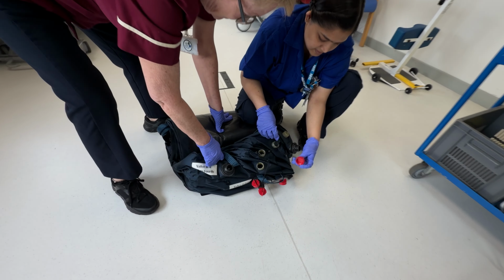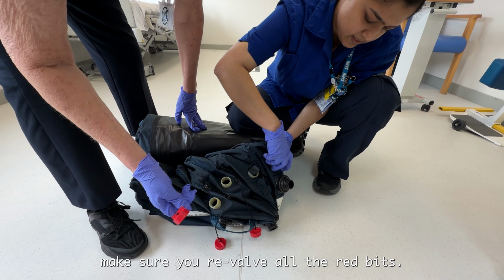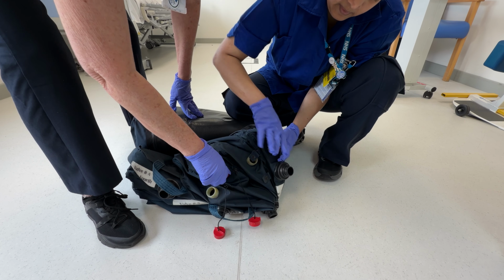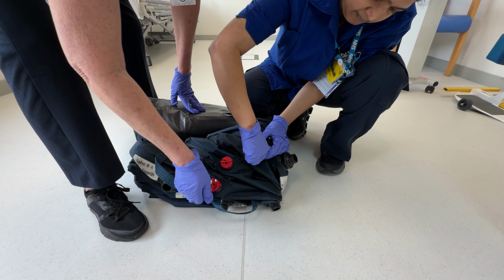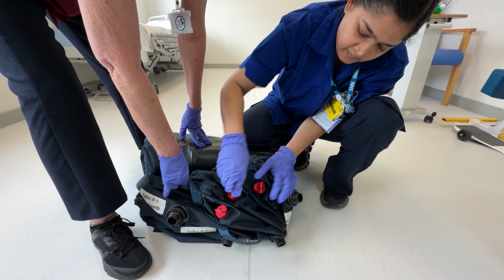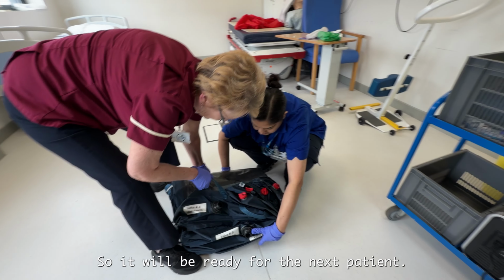Once all the air is out, make sure you revalve all the red bits. So it will be ready for use for the next patient.